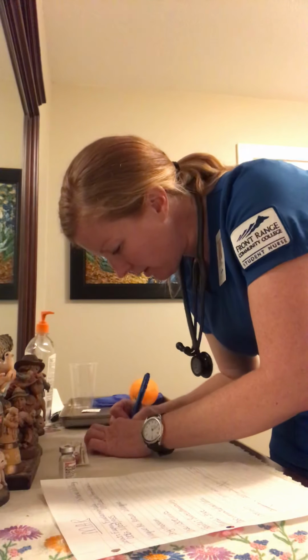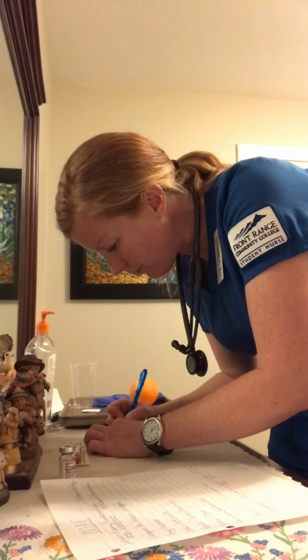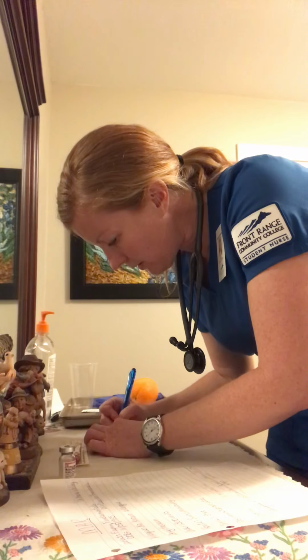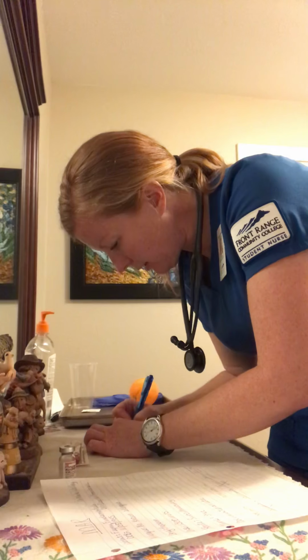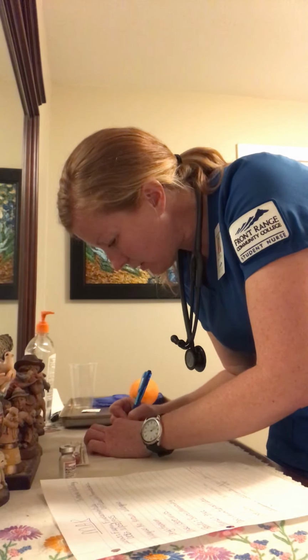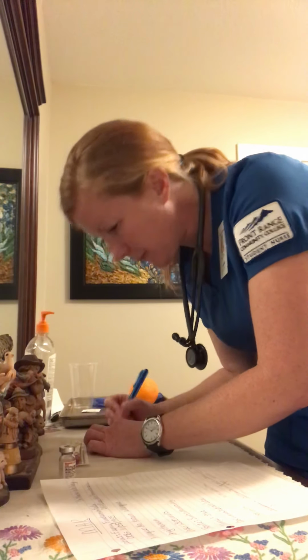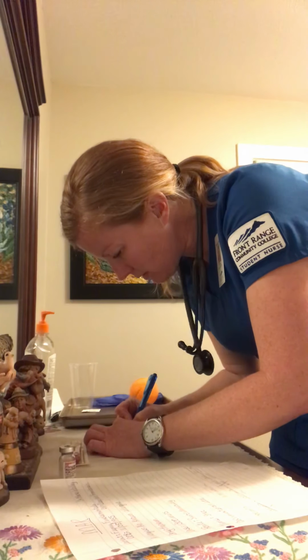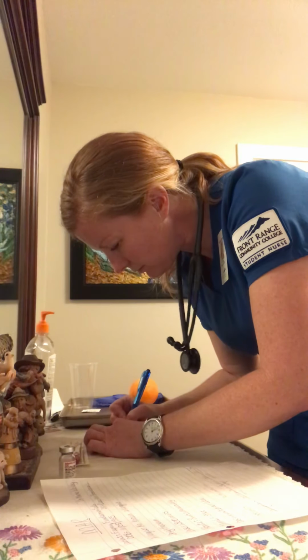So I have Fanny Fundamentals, birthday of 11/3/1955. Heparin is our drug, heparin. 10,000 units, spelled out, per 1 milliliter for that vial. We have 1,300 units is the dose, subcutaneously.